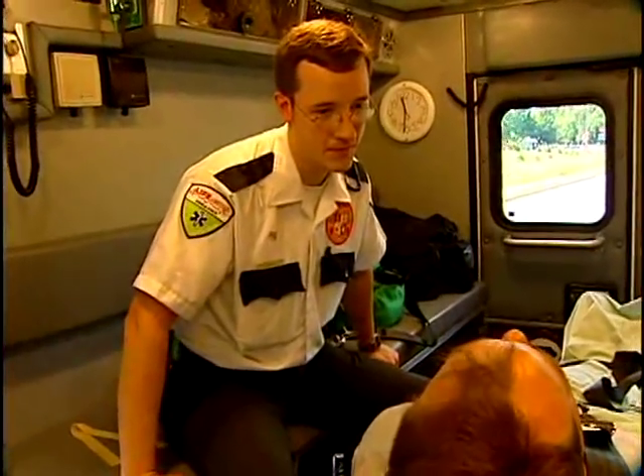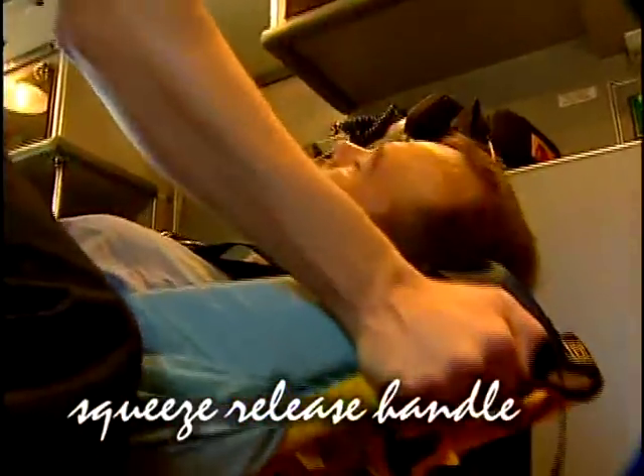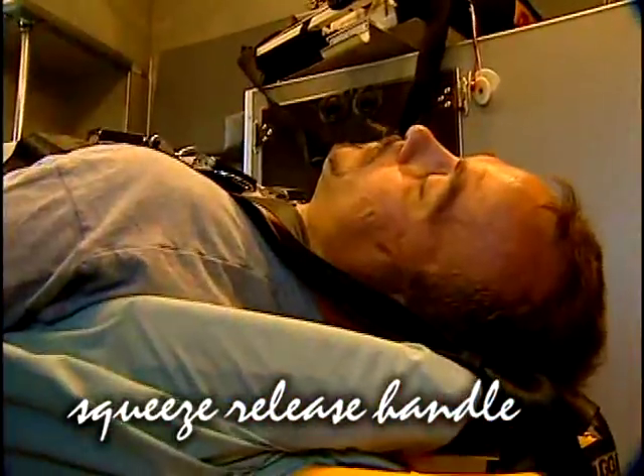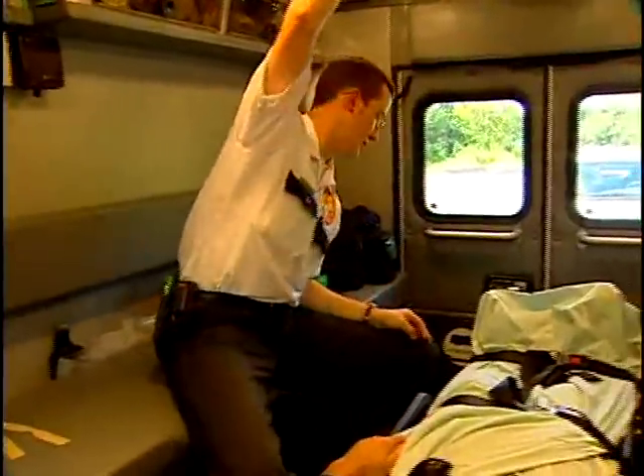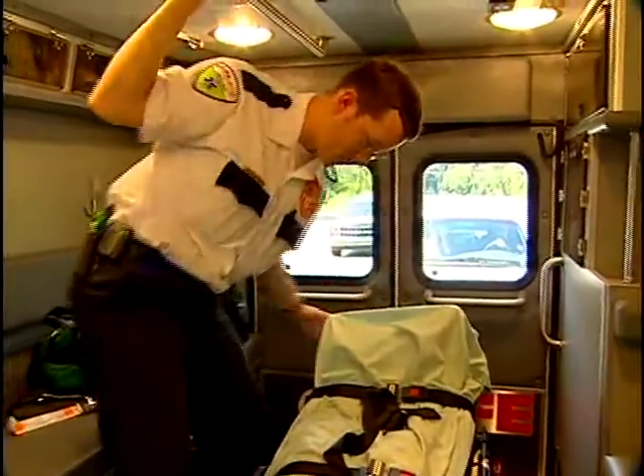Have you ever had an IV? Even in the confined space of the ambulance, the MX Pro helps me do my job. A pneumatic backrest helps position the patient. You can move into a Trendelenburg or shock position by just lifting the foot end until it locks into place.